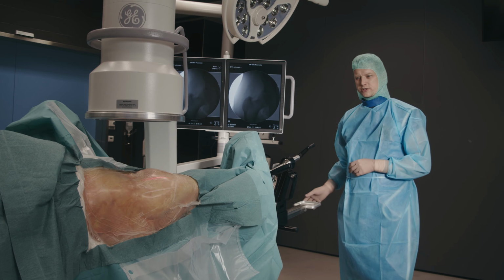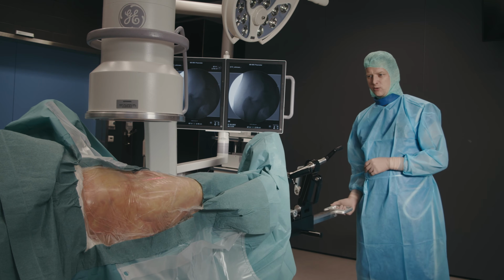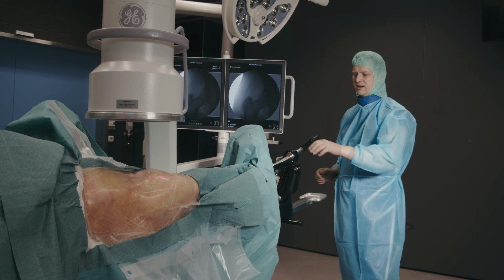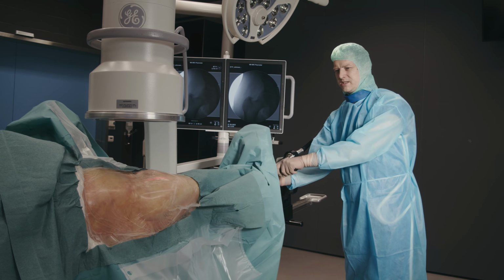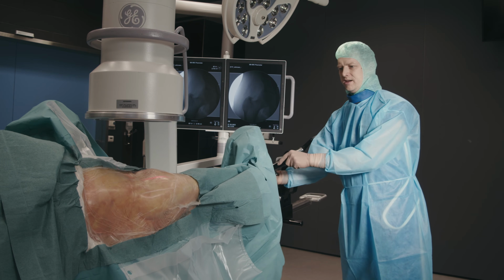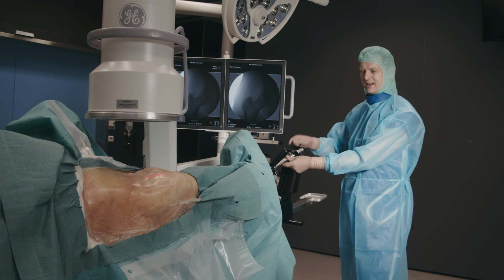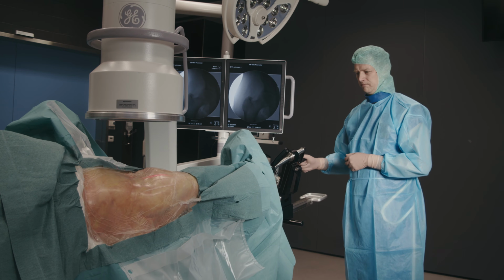The traction table is used for the purpose of reduction. The leg can be adjusted to abduction or adduction and also into flexion or extension. Adjustment of the rotation is also essential in the reduction of trochanteric hip fractures. Due to a trochanteric hip fracture, the limb typically rotates externally, and this is corrected by internal rotation of the limb. With the help of traction, you can also correct impaction of the fracture and obtain correct neck-shaft relationship.